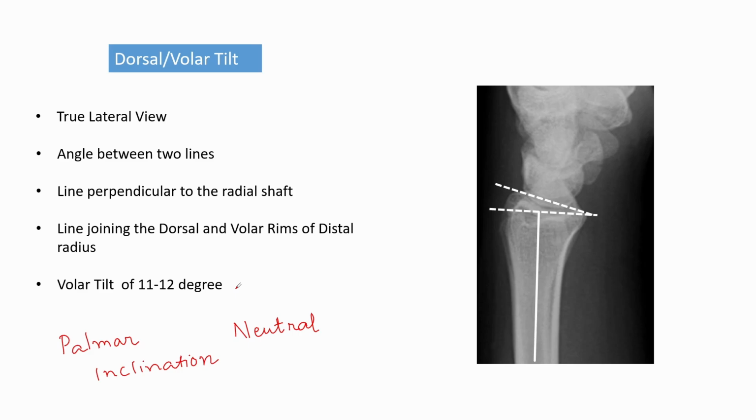So friends, this was a discussion on the radiographic parameters seen in distal radius fractures.